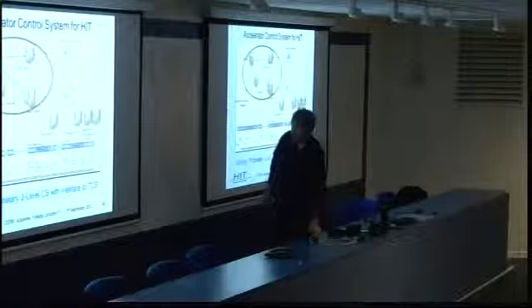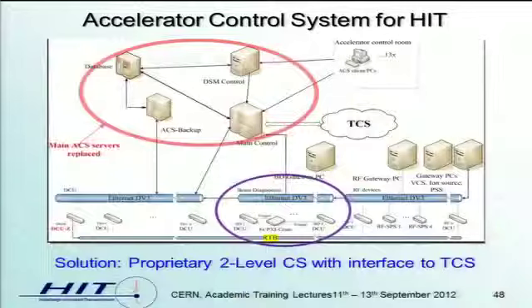What we decided from the beginning, because we had some bad experience at GSI, was to embed the beam diagnostics directly here. In our case, we decided to have PXI crates, but they act more or less as the DCUs here. They have the same software structure and they are completely embedded.